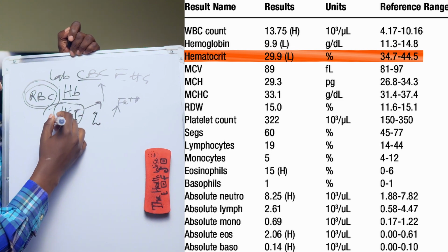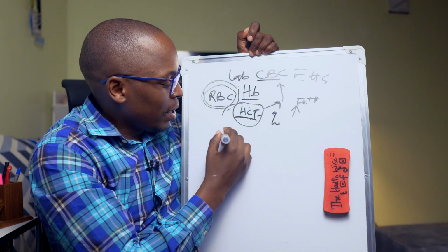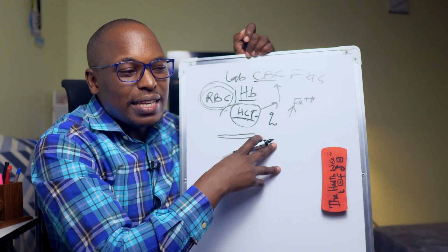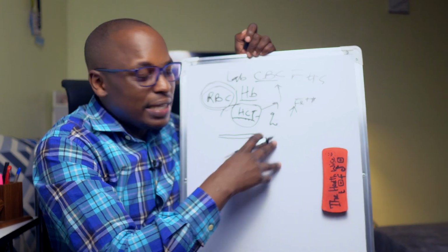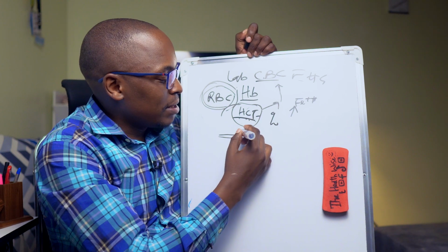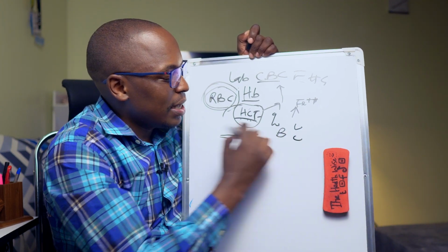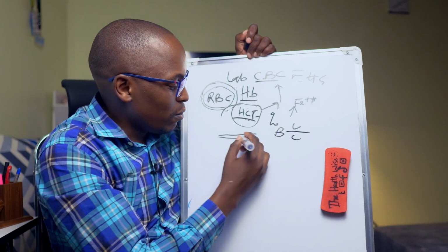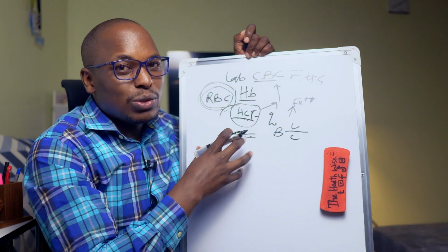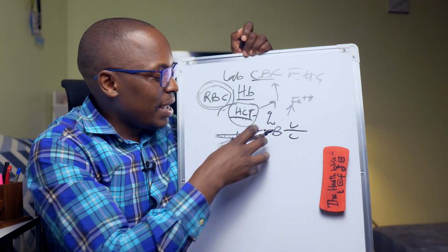Now, what happens here is, in a standalone HCT, your blood is taken and put in a very tiny tube. They spin that at very high speeds. And then what will happen is the separation. Remember, we said blood contains the liquid part and also the cells. Now it's going to separate these two so that you get the cells here and the liquid part here. This will give an indication of the ratio between the liquid part of your blood and the cells.